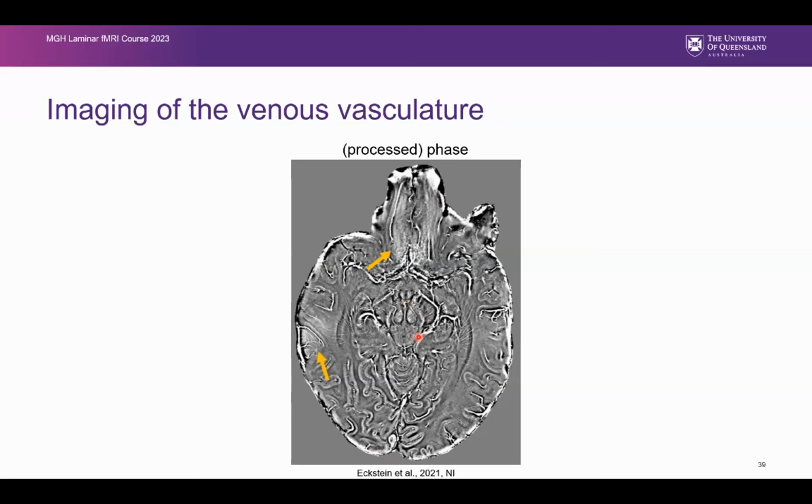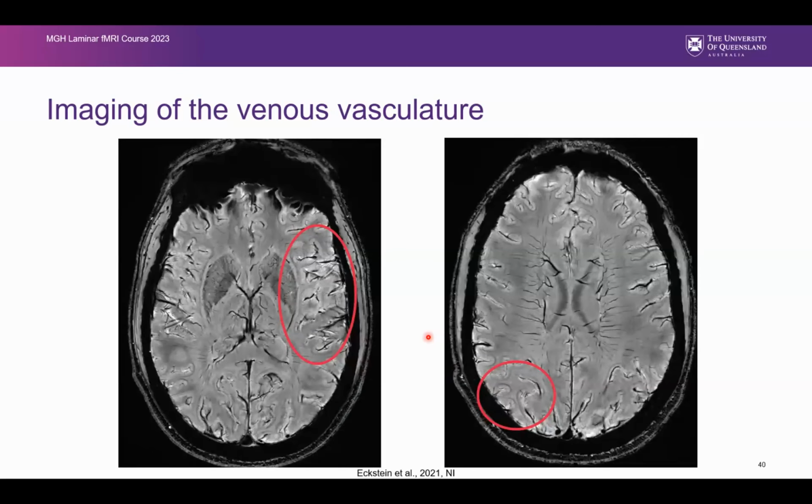Around really large vessels you get a massive contrast change from white to black and then to gray, or sometimes white, black, gray. This makes it an unfortunate and not very suitable contrast if you think about segmentation.